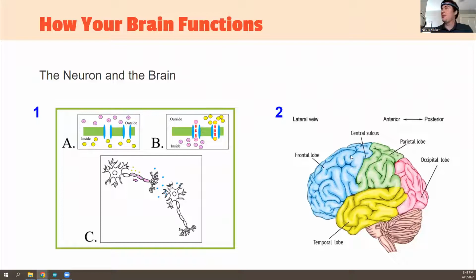The crash course is, this sensor is on the front of my head on what is called the frontal lobe. This part of the brain is what regulates things like cognition, like really thinking about something and reasoning through it. So if you're thinking hard about something, if you're relaxing, something that requires mental energy. If you were ever solving a complicated math problem back in high school and you're looking at your notes and you're just straining and thinking, a lot of that is frontal lobe activity.